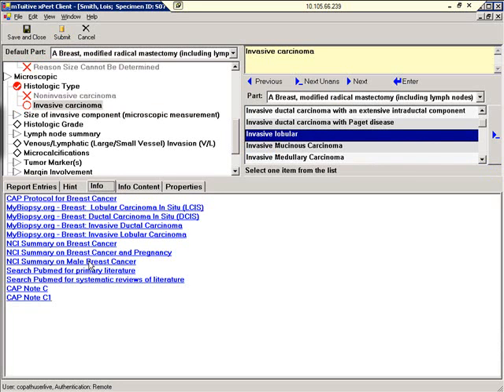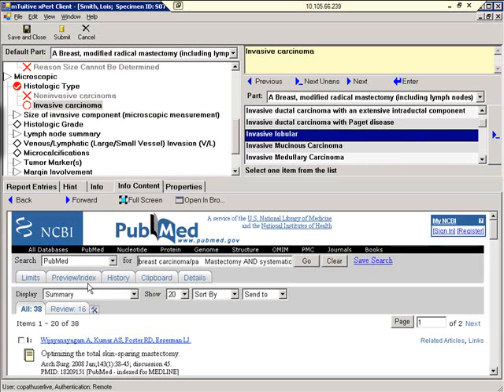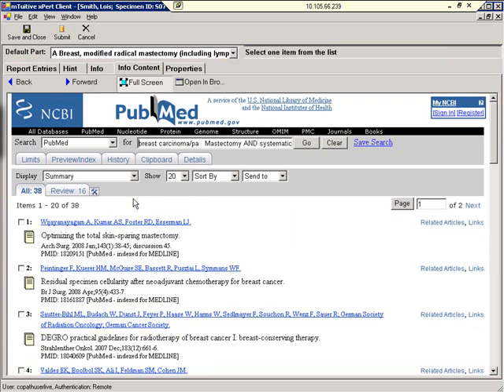We'll click on Info, and we'll click on Search PubMed. What the system has done is it's gone out to the PubMed website and performed a contextual search. In other words, it has just retrieved information that is applicable to the case you are working on. There are only 38 cases out of all the available cases on PubMed that apply.